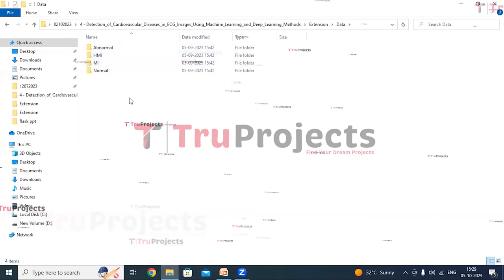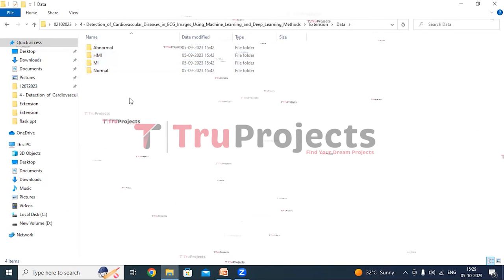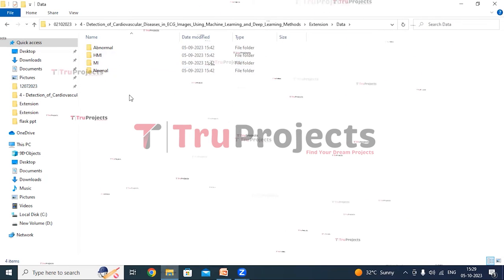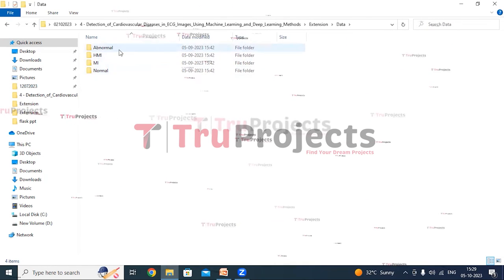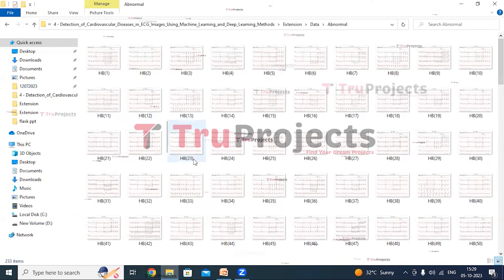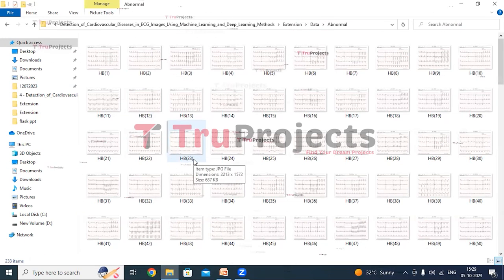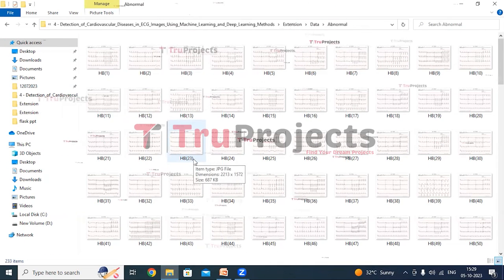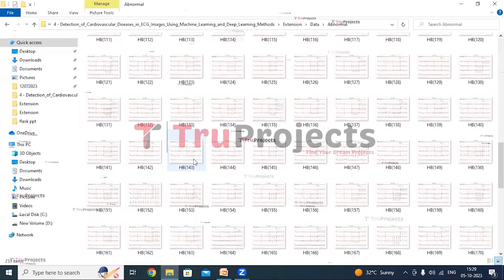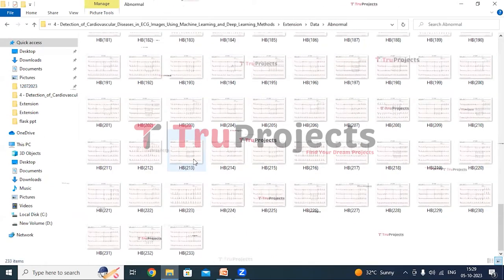This is the dataset folder in which there are four different class images on which we will train models. The first one is abnormal. Abnormal images show heart patterns that aren't normal, indicating potential heart issues. These are all the abnormal images.